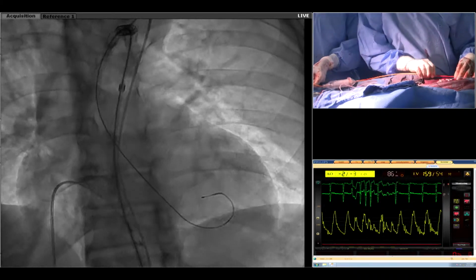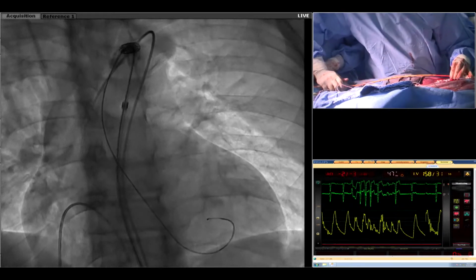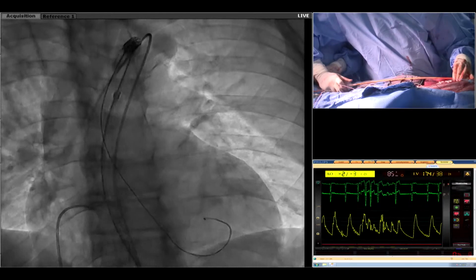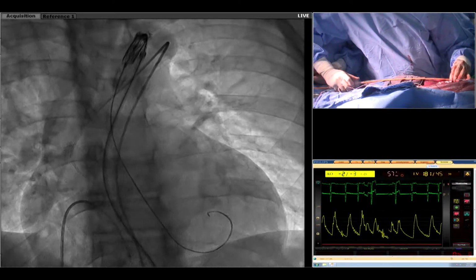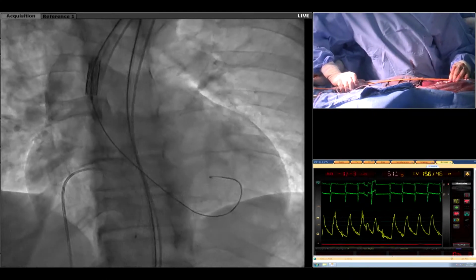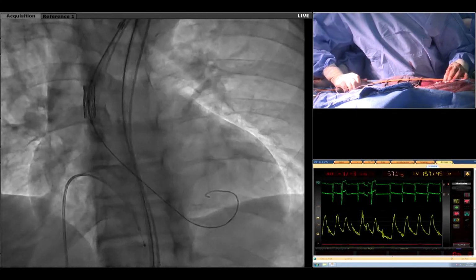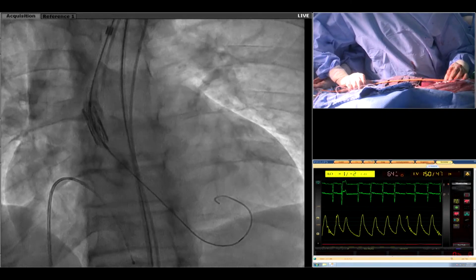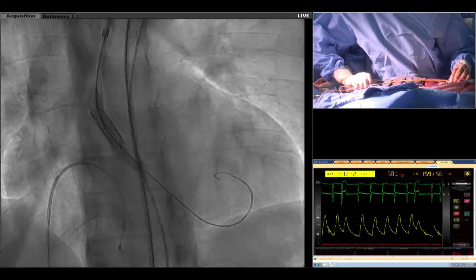There's a lot of resistance here at the arch, so we're gonna torque it more. Okay, so I think this is the advantage. Mag up a little. So we're gonna cross. Okay, focus on the valve here. We're gonna enter here.